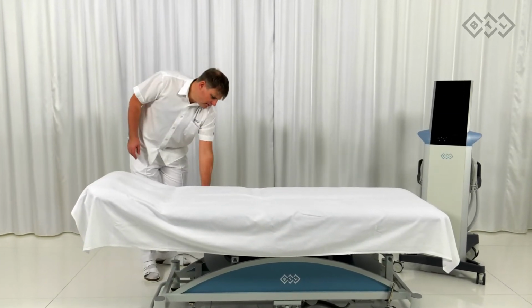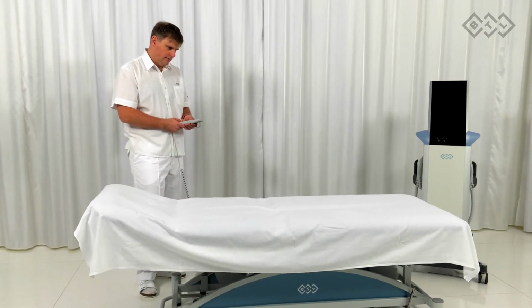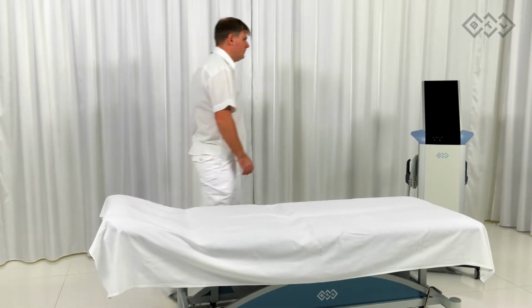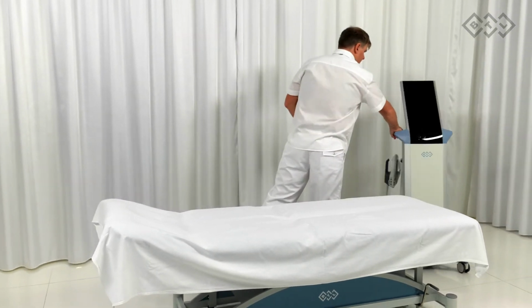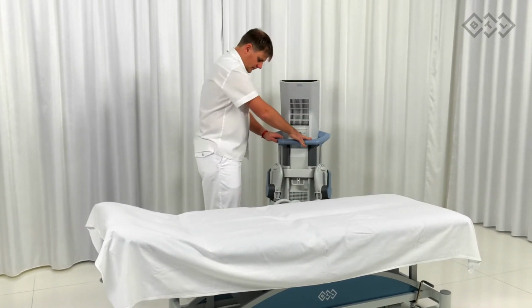Position the device near the treatment bed as demonstrated. Do not place the device in direct sunlight or near heat sources, as it may lead to an excessive temperature increase for the device. Also, do not cover the device or the applicators during the treatment.